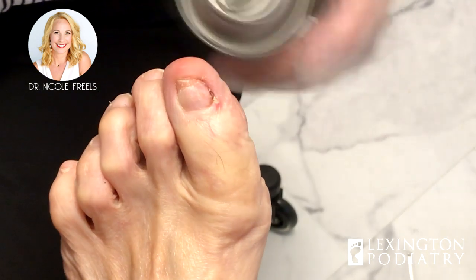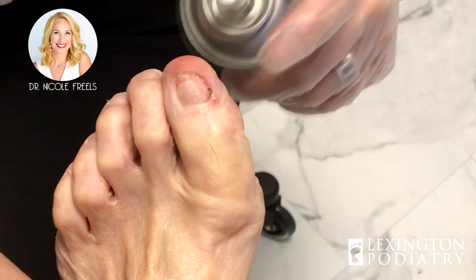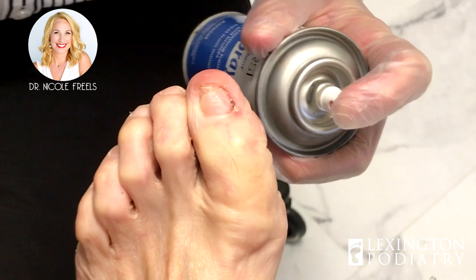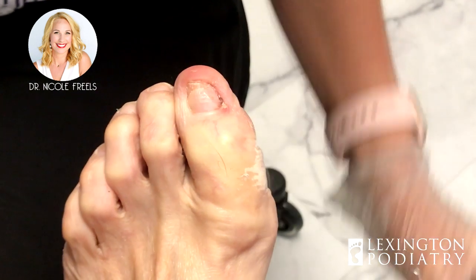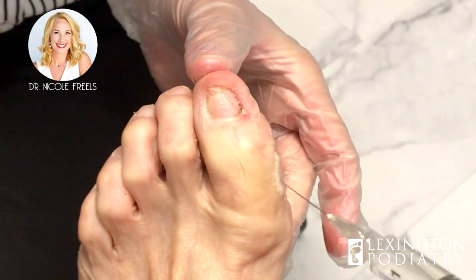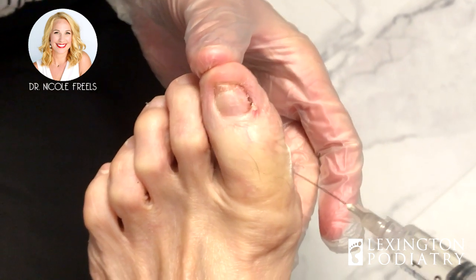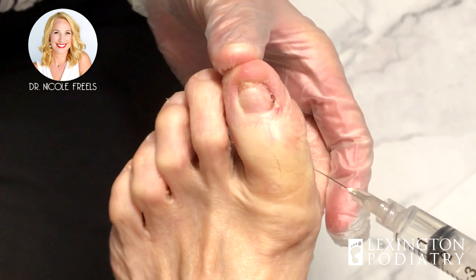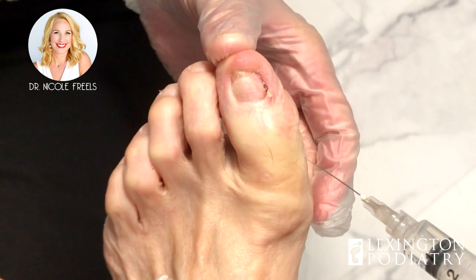We talked about the reason she couldn't get it — even if you get tweezers in there, the root of the nail is all the way back here, so you've got to go digging. Plus where it's connected to the good healthy nail, you would likely damage that area as well and then introduce fungus or maybe infection, something like that.